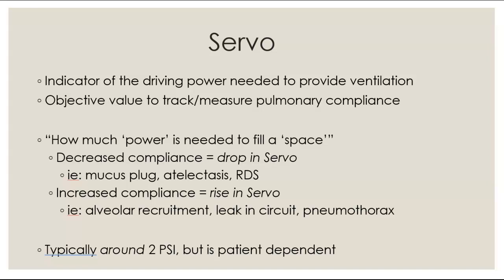But if we have increased compliance, all of a sudden we have all this space we need to fill up, and we need all the driving power to fill up this space. We have a rise in our servo pressure. So that allows for alveolar recruitment. Say we have alveolar recruitment that's occurring.